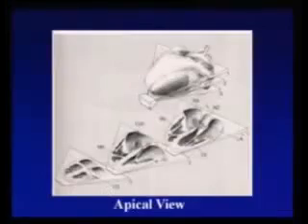So again, with anteroposterior scanning at all levels we see which is left-sided, which is right-sided, meaning we have to define the morphology. In the four-chamber view, we look for the attachment of the mitral valve and the tricuspid valve, identify the right ventricle and left ventricle, and the concordant or discordant connections.